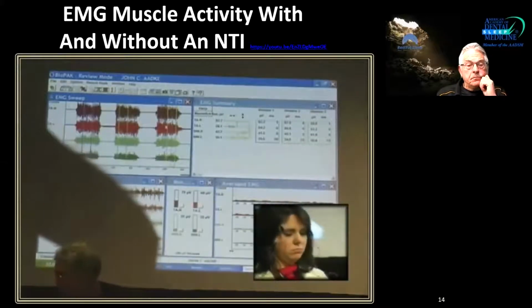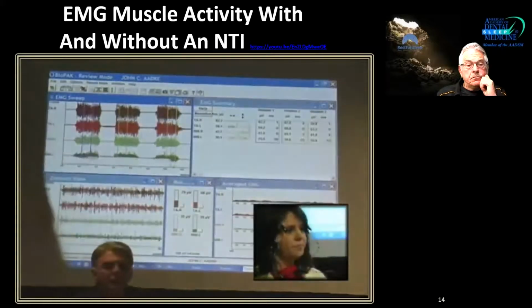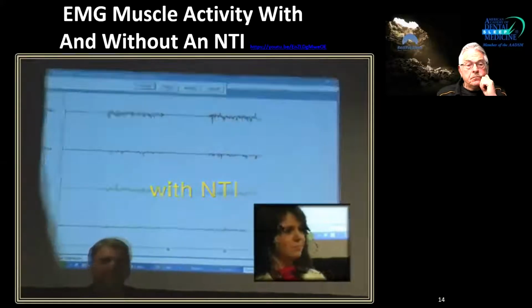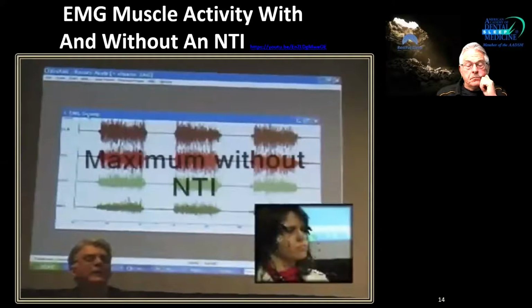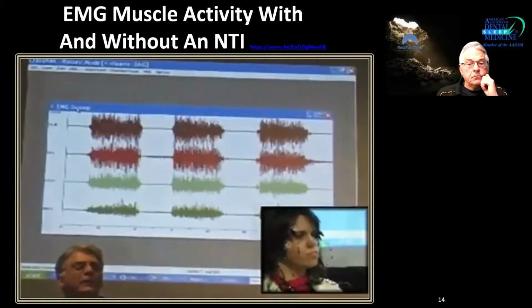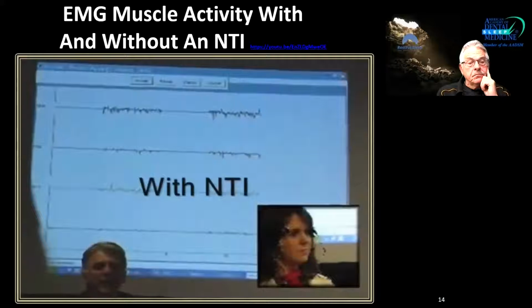Want to put it in now for me? When I say go, I want you to start to clench. Go, clench, clench, relax. Go, clench, clench, relax. Look what happens to the ability to clench.